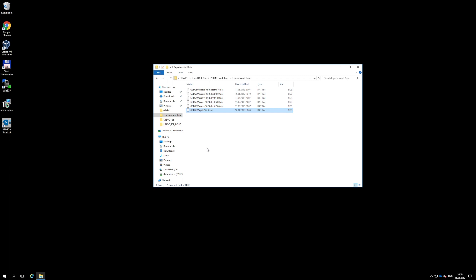Each experimental profile must be written in a separate file in ASCII format and the file name must have the .dat extension. The file name must only contain alphabetic characters from A to Z, numbers, underscores, and hyphens. No other symbols, including blanks, are allowed. One dot must only appear to denote the extension.